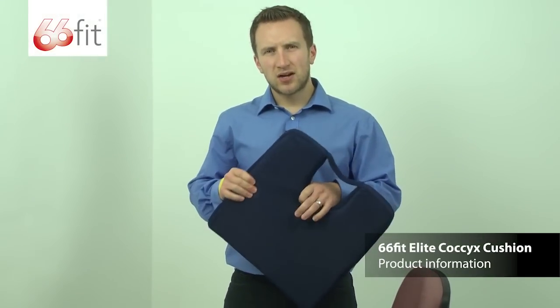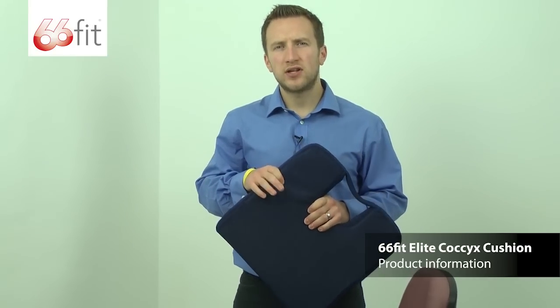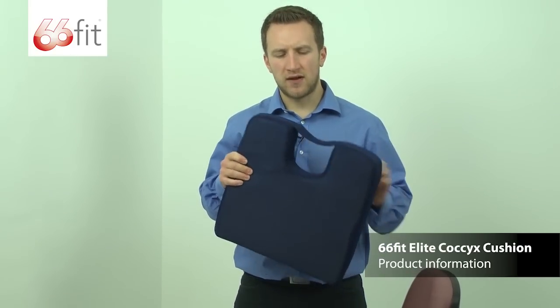This is the 66 Fit Elite Coccyx Cushion. This is designed to relieve pressure or any stress on your coccyx following an injury or if you've had surgery to that area.